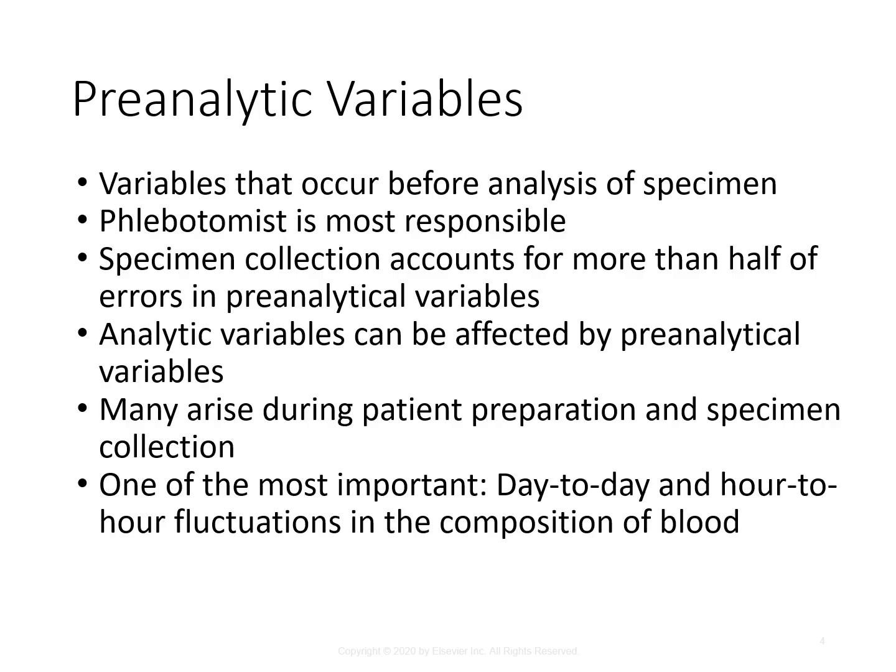To minimize the effects of day-to-day and hour-to-hour fluctuations in composition of blood, the reference ranges for blood tests are based on healthy patients and what is known as the basal state of the patient. In the hospital, the routine phlebotomy rounds are generally scheduled for early morning, because that's when most patients are in their basal state.